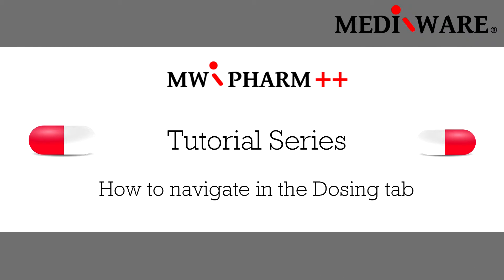Hello and welcome to our series of learning videos about TDM software MWFarm++. The topic for this video is how to dose the drug in the dosing tab.